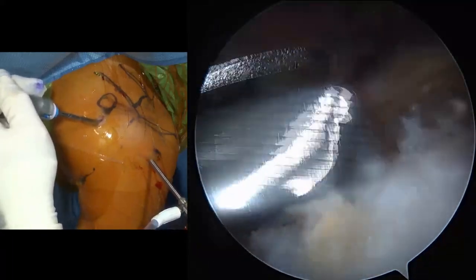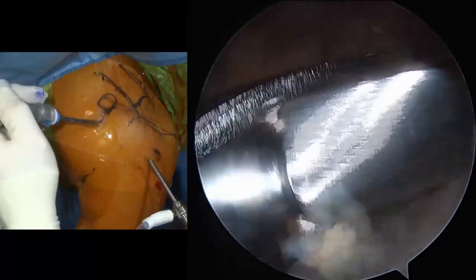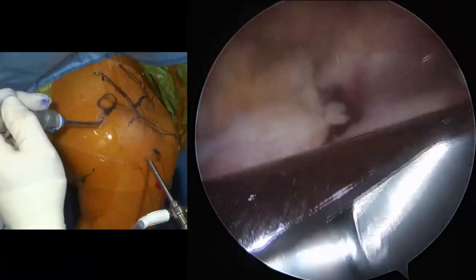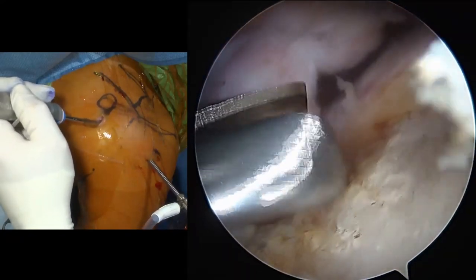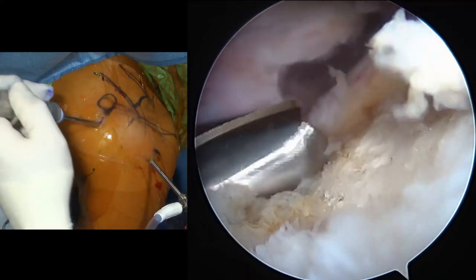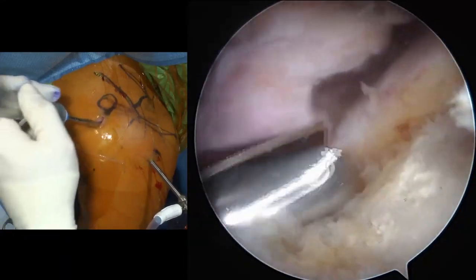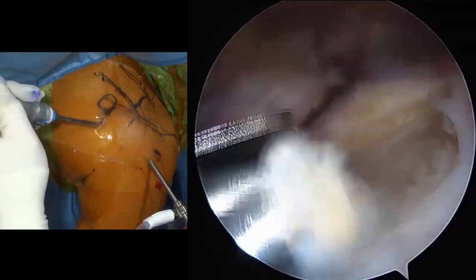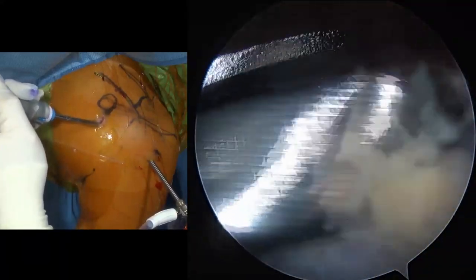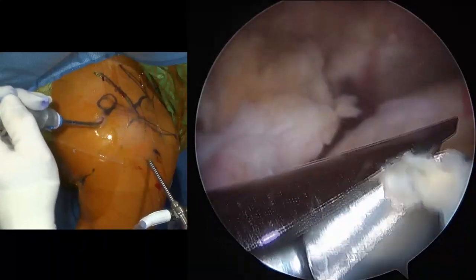So when we prepare the tuberosity, the things that have been associated with better healing include just lightly scuffing the bone and not going through the bone all the way down into the cancellous bone, but leaving enough of the subcortical bone so that the anchors hold very nicely. Other things that have been associated with it has been putting small holes into the bone itself to try to get the blood supply to improve. And so there's some evidence that works.